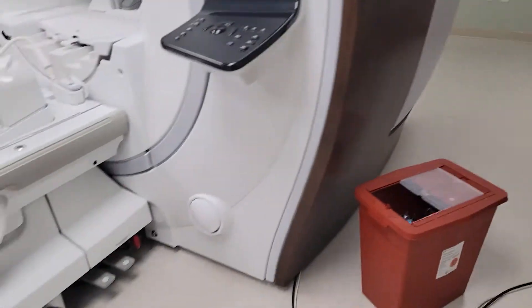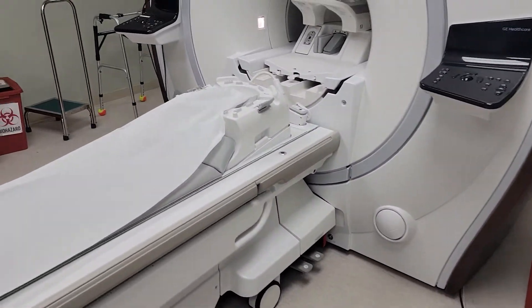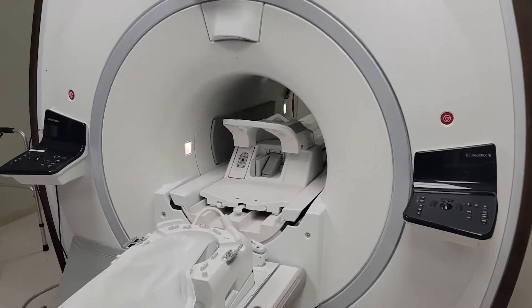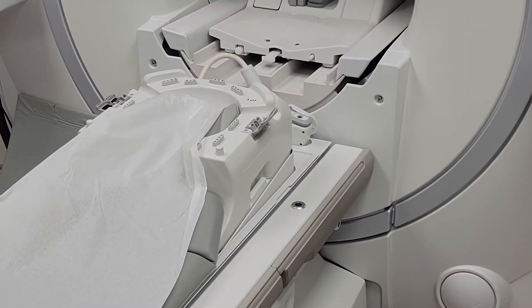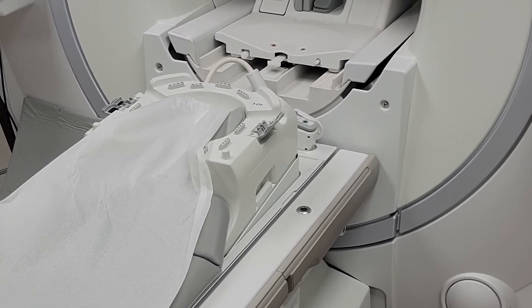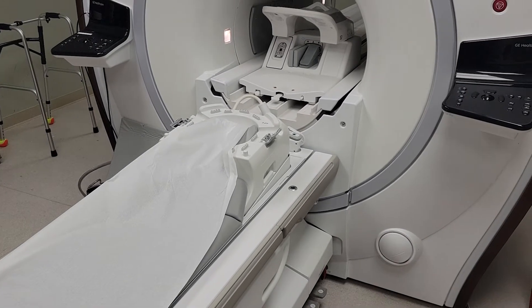And then on the table you have the brain coil. You see the top of the brain coil right there — lay that on top there. Brain, neck, c-spine, that kind of stuff.